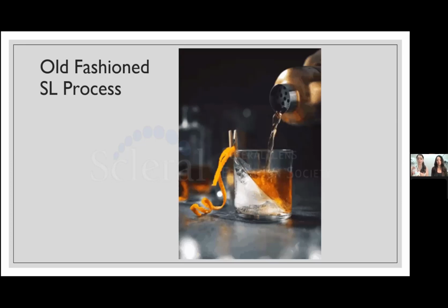So if you don't want to put in that lens and take out the lens, because it does take a lot of time away from you to do these things, then have that technician learn how to put it in, take it out confidently. Have them swap on over to the OCT, take a central vault, and then see, okay, is it in my practitioner's sweet zone, as we say? So anything pretty much under 300 for me and over 150 is my sweet zone. So I want to take a look at a lens where the central vault looks like that.